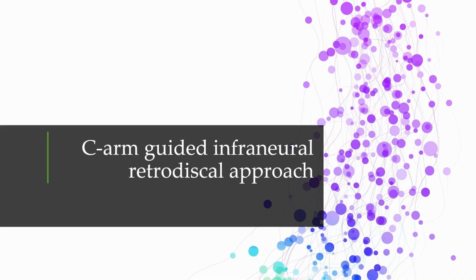C-arm guided infraneural retrodiscal approach. Our next segment will feature a step-by-step video demonstration detailing the procedure of the infraneural retrodiscal approach. I recommend reviewing the video multiple times to deepen your understanding of this method.